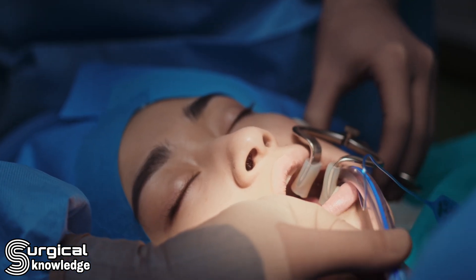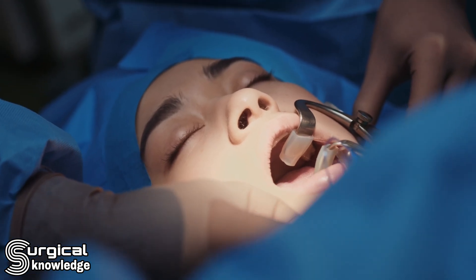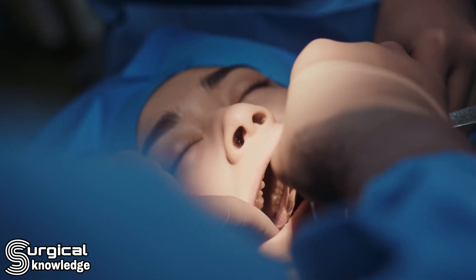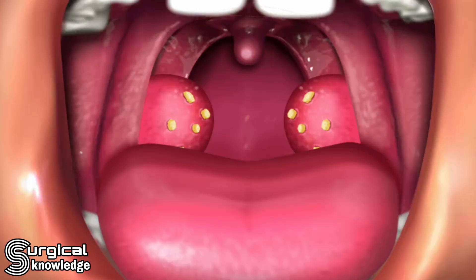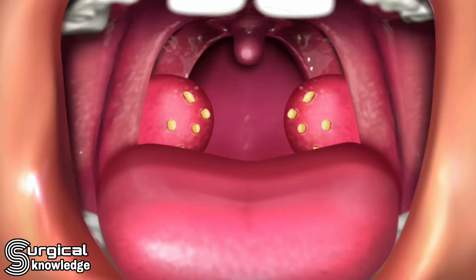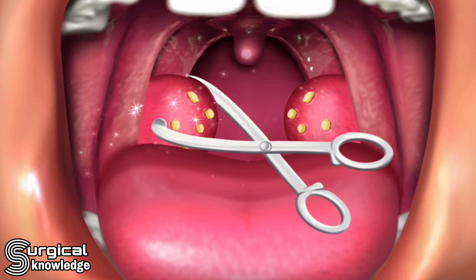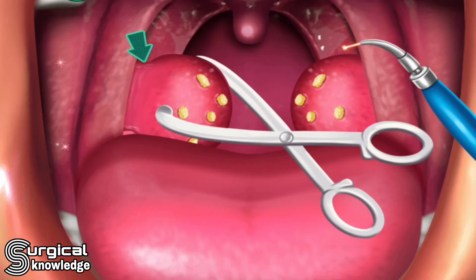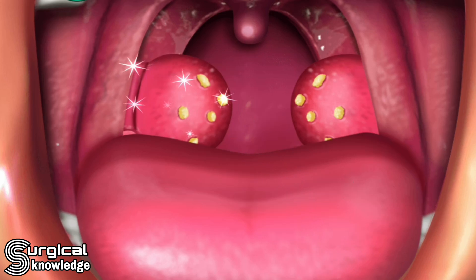The surgeon will insert a mouth retractor to keep the mouth open and use a small instrument to hold the tongue down and out of the way. The surgeon will then use cautery or specialized cutting tools to remove the tonsils from the throat.